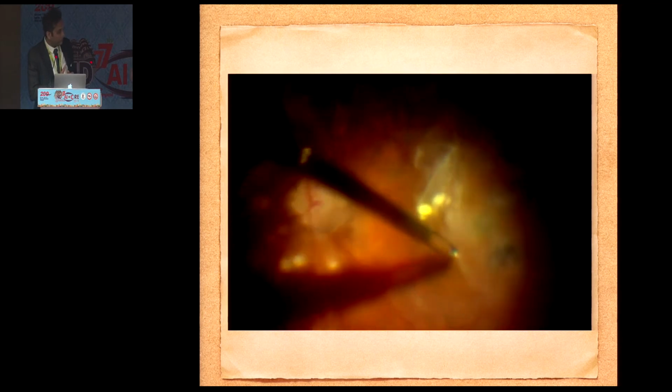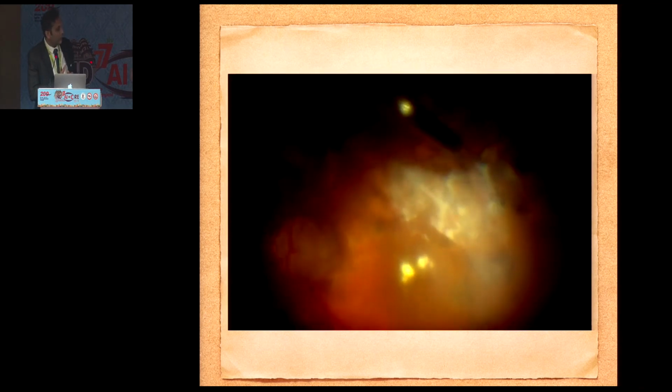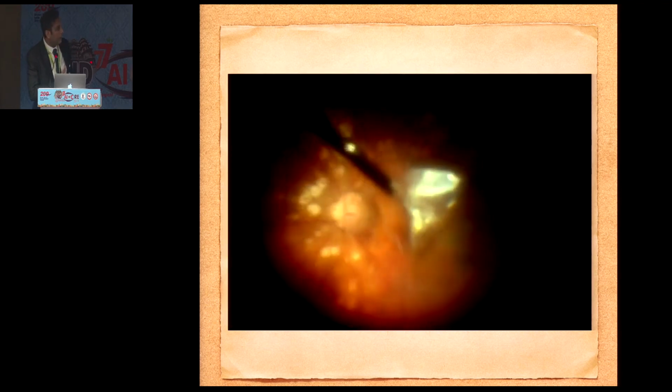have to be gentle, and these are tenacious membranes and they can create a macular hole also if there's a lot of VMT. After that you stain the macula with the trypan blue and you remove the ERM remnants before going with the brilliant blue dye to remove the thin ILM. The hypothesis says that it increases the oxygenation, and apart from the contour of the macula, it improves the vision also in around 30 to 40 percent of patients.